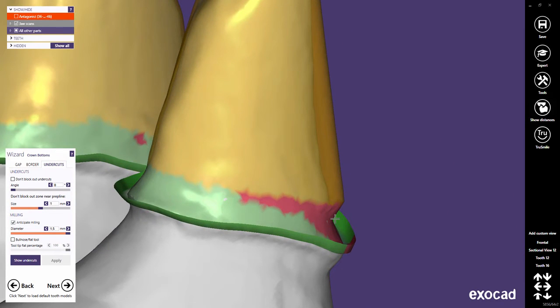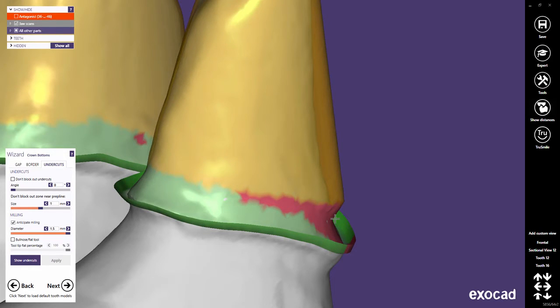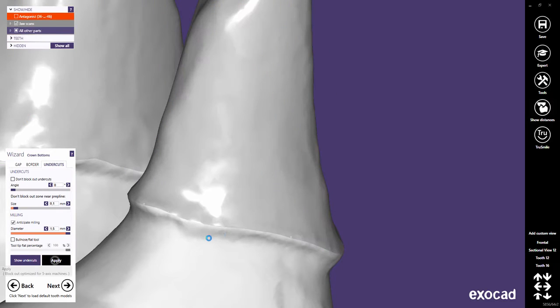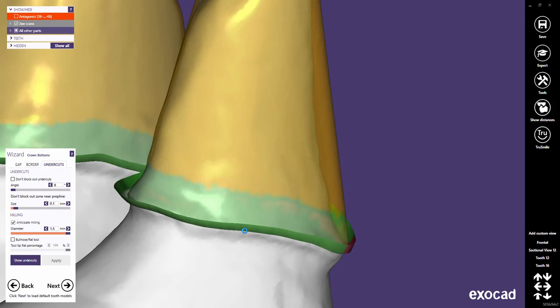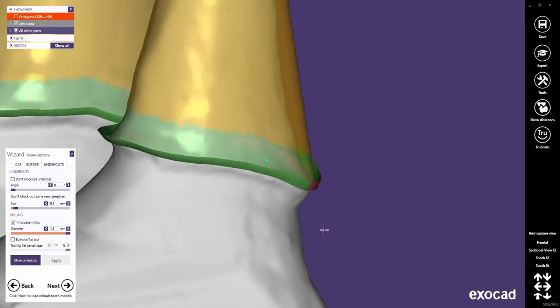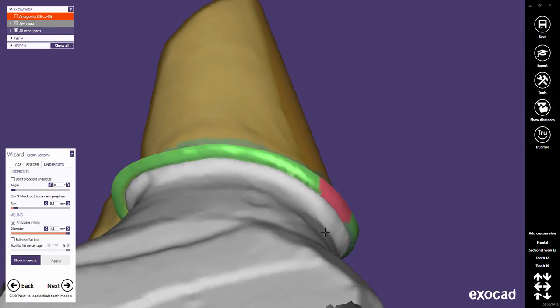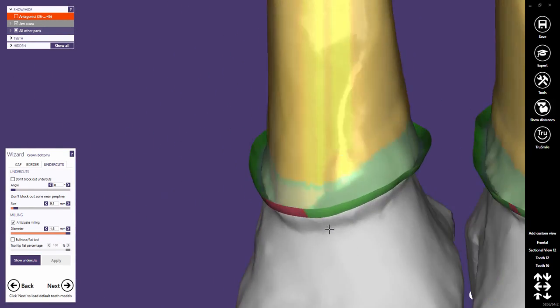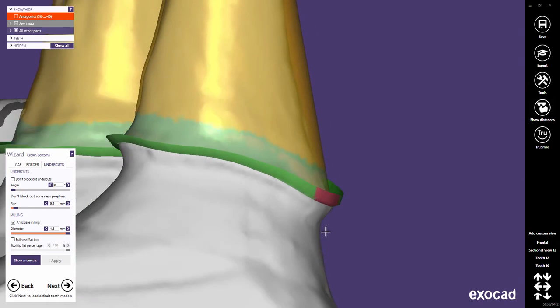Note that these settings may create undercuts in the crown bottom marked in red. It might not be possible to produce this kind of restoration with 3-axis milling. The default value in our generic version is 0.1 millimeters. This means that just a very small area at the crown margin has not been blocked out.